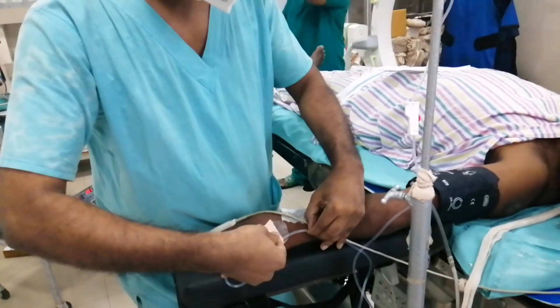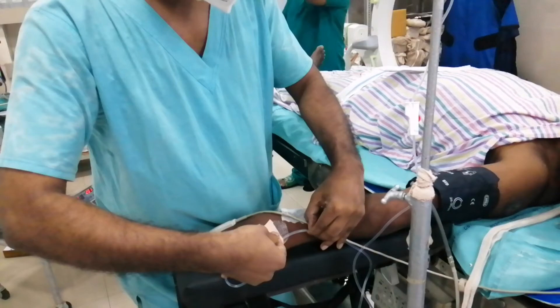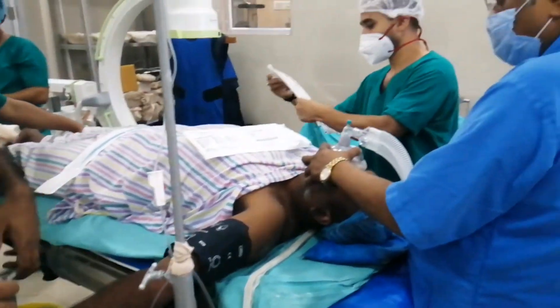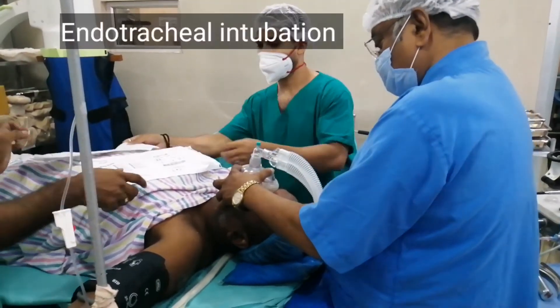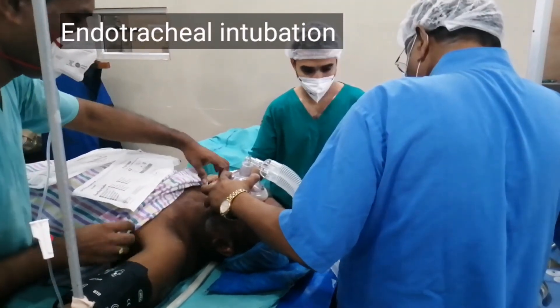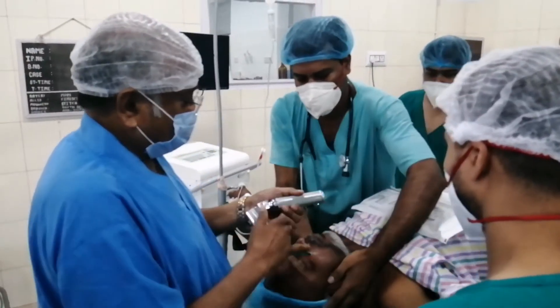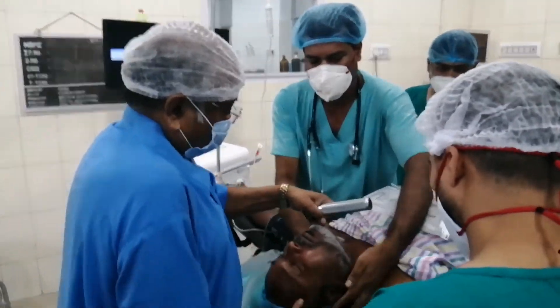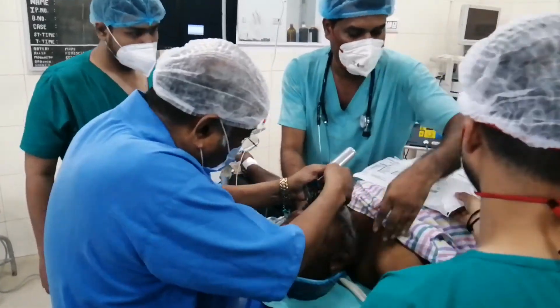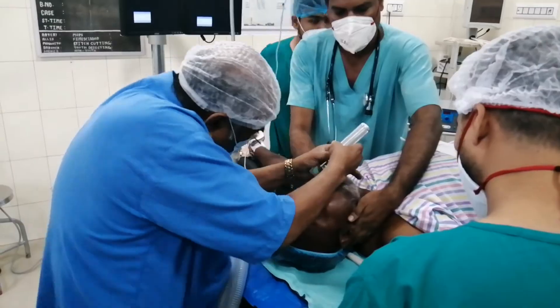An intravenous muscle relaxant is given to relax the patient's muscles. Now we are ready for endotracheal intubation — that is, putting the pipe inside the trachea. This is the laryngoscope through which the doctor visualizes the vocal cords.